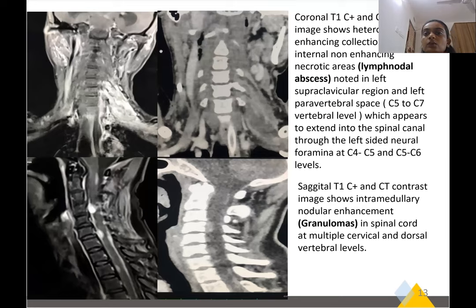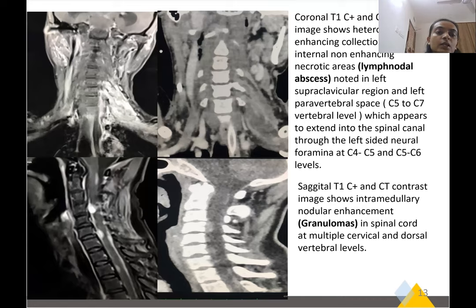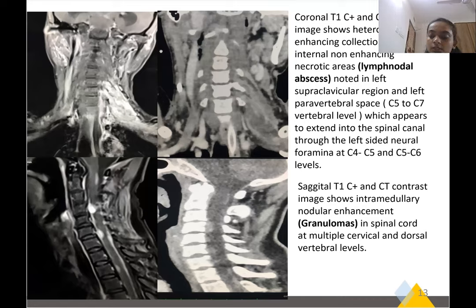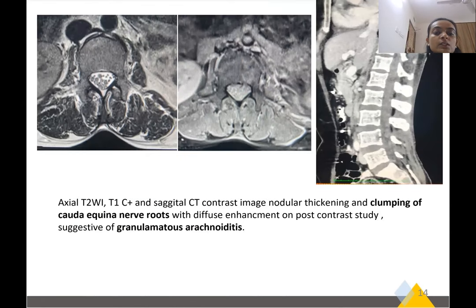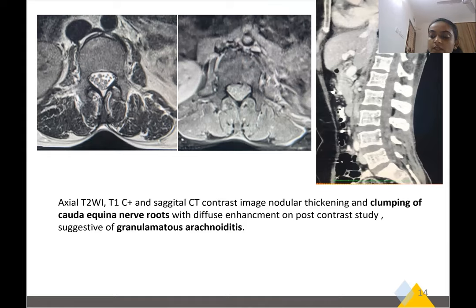Another patient: on coronal contrast T1 and CT images, a collection is seen in the left supraclavicular region extending into the spinal canal through the neural foramina. On sagittal image, a granuloma is seen which is also appreciated on contrast CT. Another case shows axial T2, T1 contrast, and sagittal CT contrast images with nodular thickening and clumping of the cauda equina and nerve roots with diffuse enhancement on post-contrast study, suggestive of granulomatous arachnoiditis.